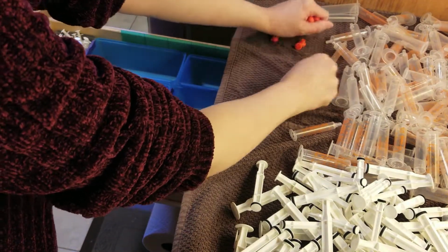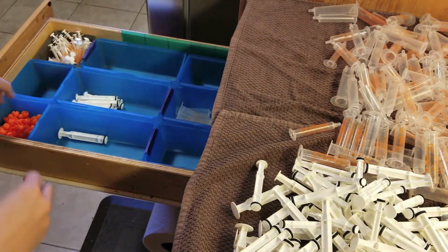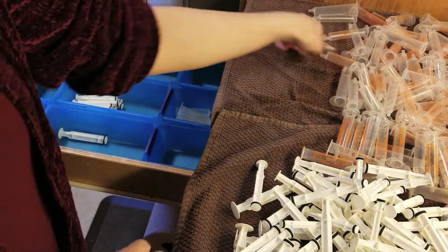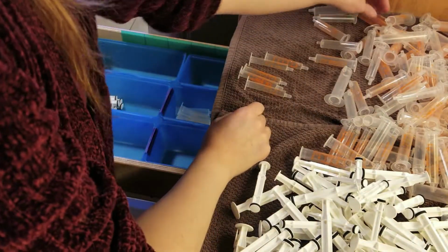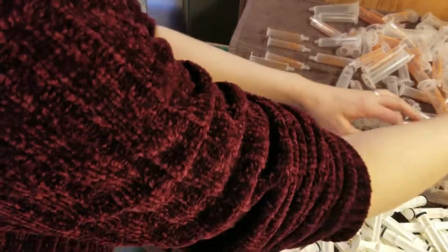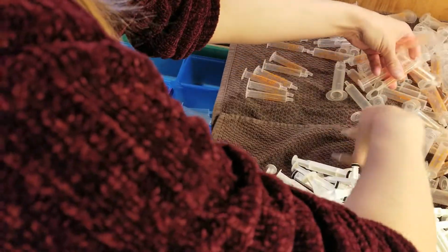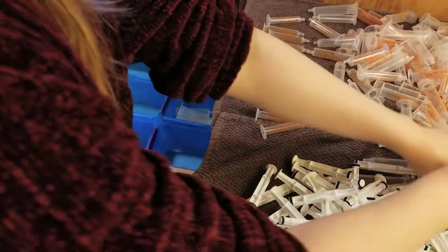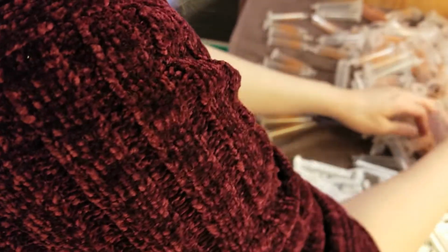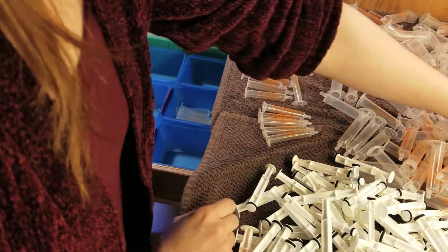So first thing I do after the syringes are washed and dried is I put them away. Each size gets its own compartment. I find it easiest to organize the syringes by size, starting from the smallest, moving my way up. Depending on how many medications your family uses, you could have a multitude of different sizes. I believe we have 4 different sizes that we use.